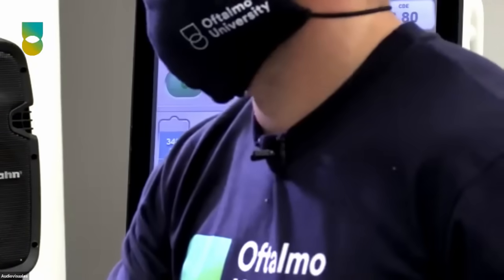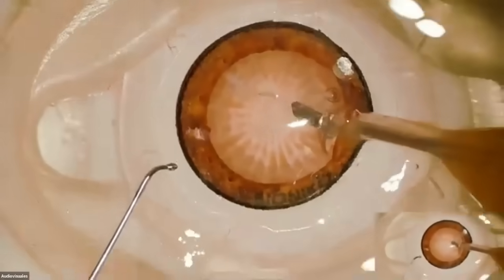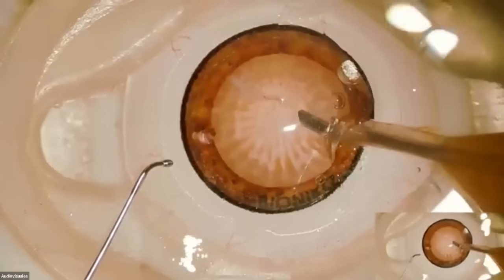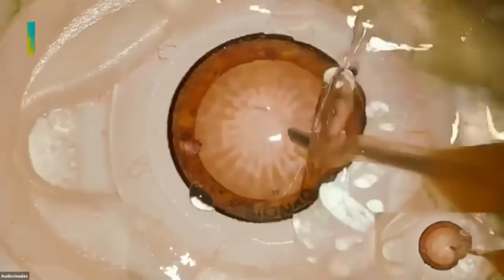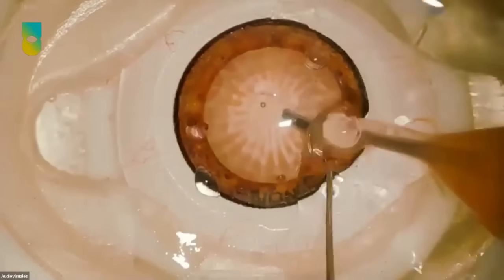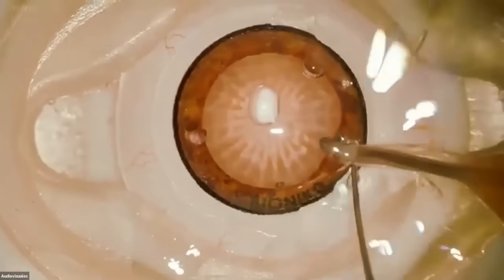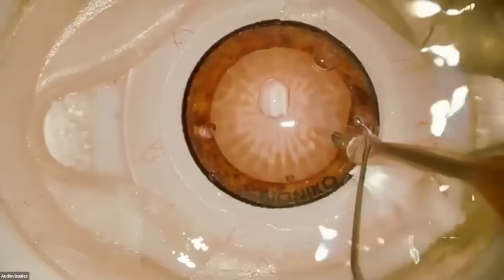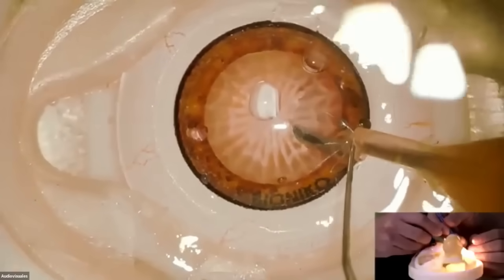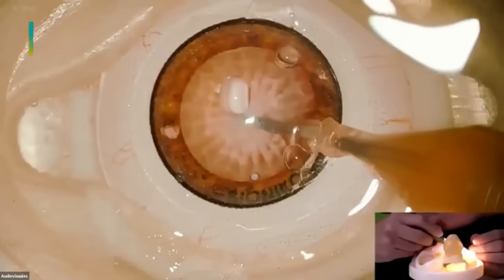Yeah, definitely. I think the most difficult is the Capsulorhexis, but phacoemulsification involves different movements. So that's the beauty of this surgery: during the procedure you have to perform different hand movements and finger movements to perform a very nice surgery.